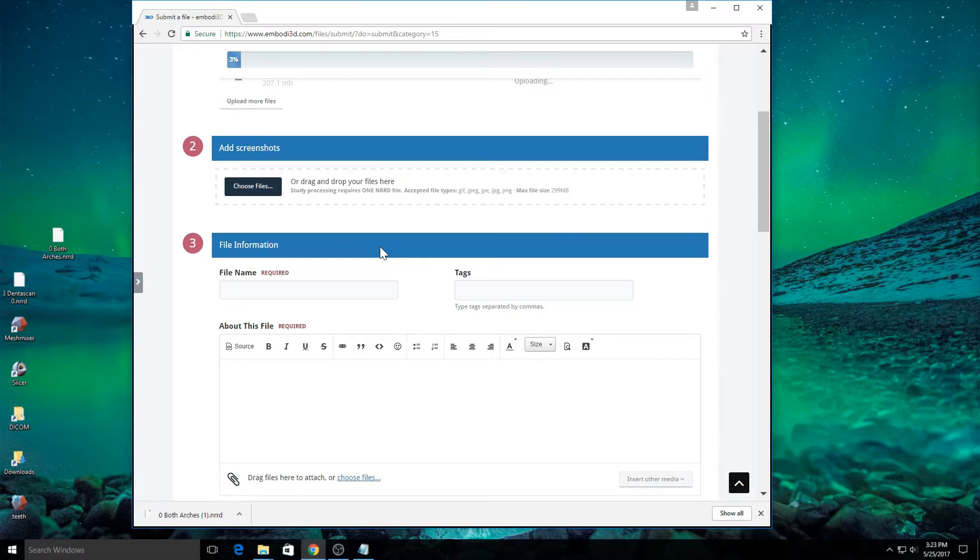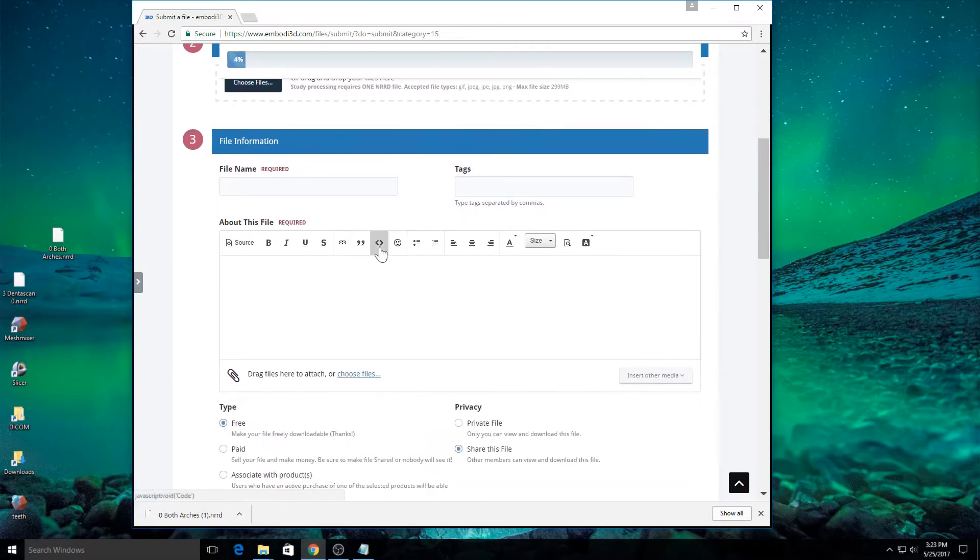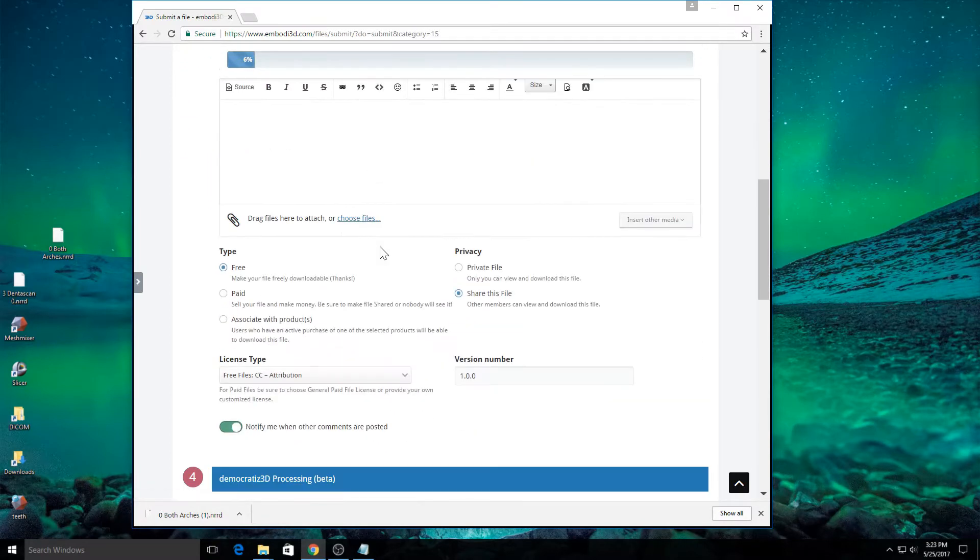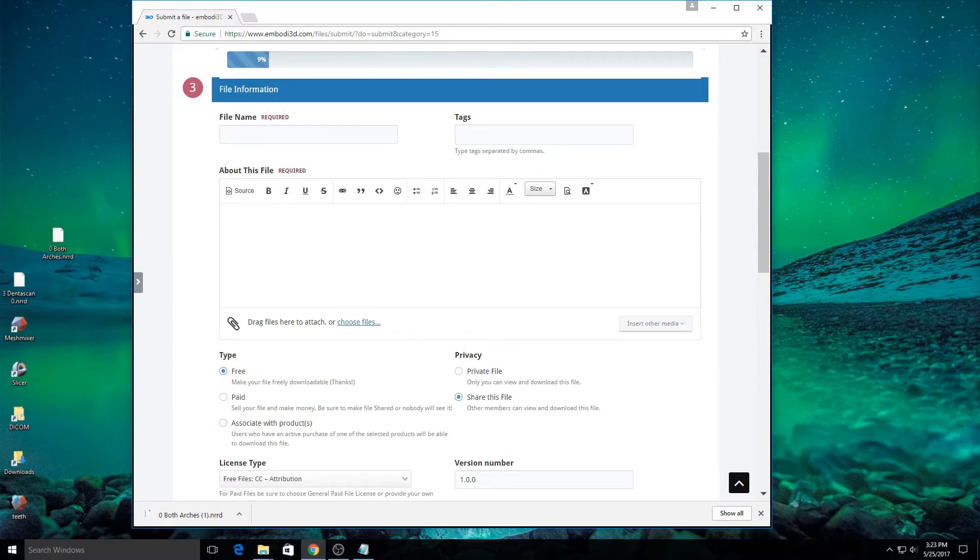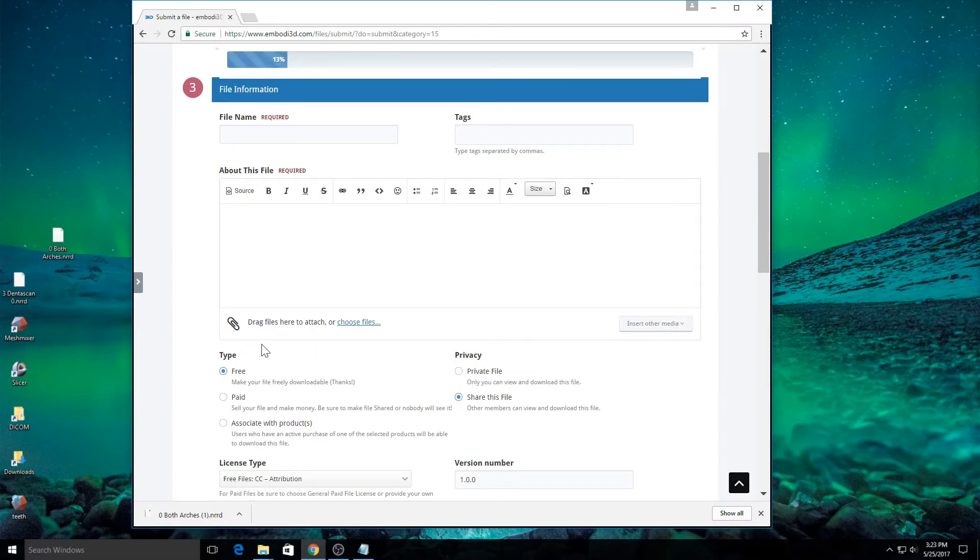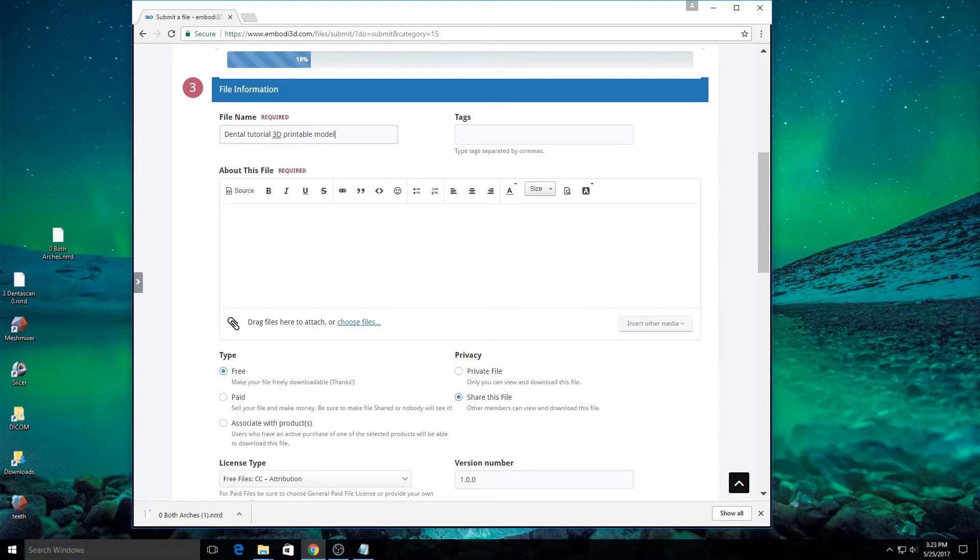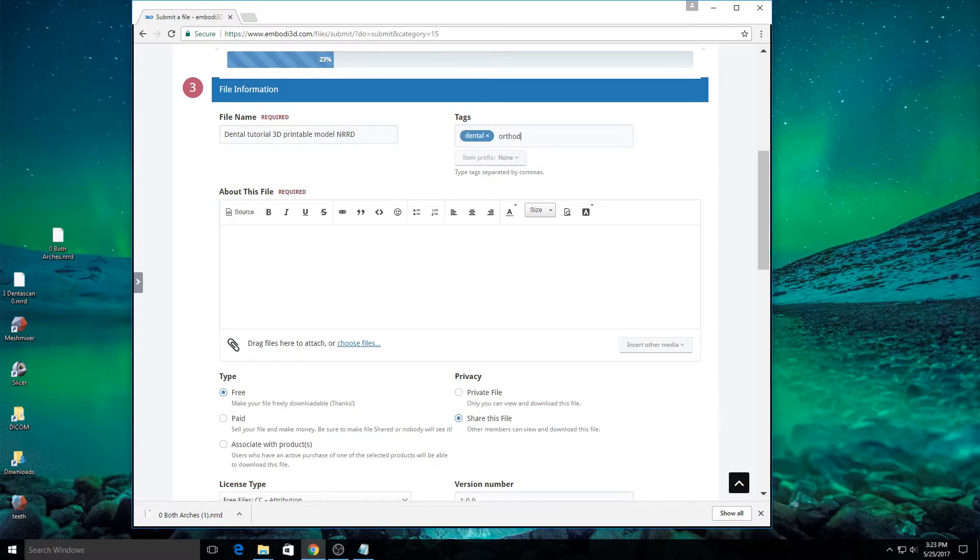While it's uploading, I'm going to enter in a little bit of information about the file and the file that I hope to generate with this service. The first thing, this section, section 3, is about the file that's being uploaded. So, the NRRD file. I'm going to type in a file name here. I'm going to call this a dental tutorial 3D printable model NRRD file. I'm going to put a few tags in here. Orthodontic, NRRD, et cetera.